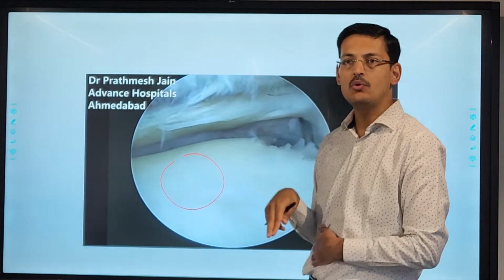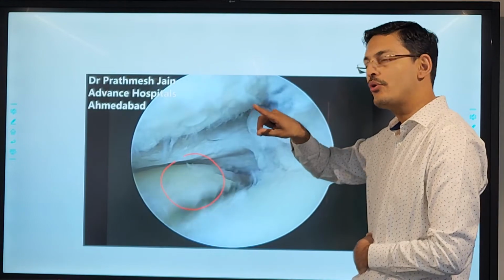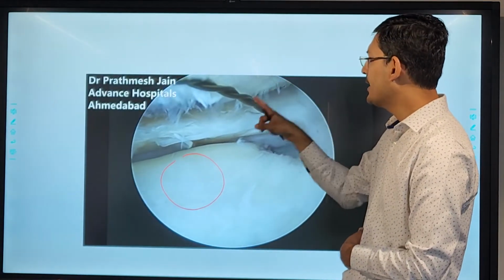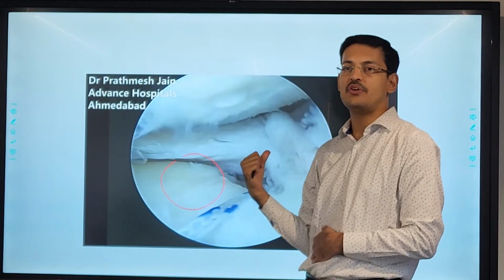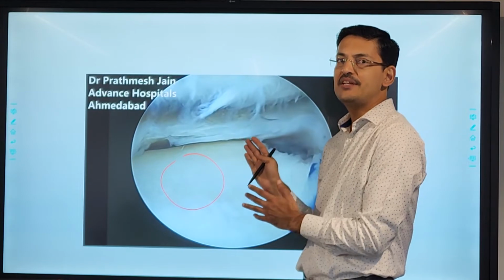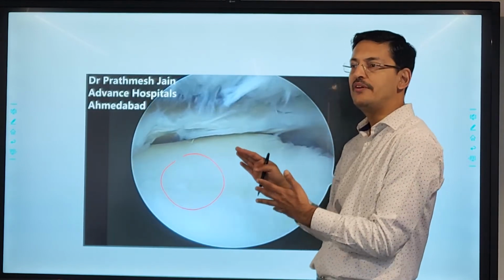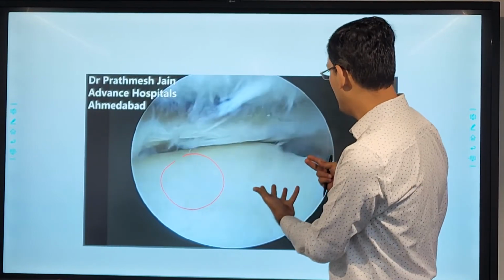And then we'll take out the nitinol wire from there, and we will retrogradely load the anchor from this wire. Now this is easy insertion of the anchor as compared to the posterior medial insertion that I told you before, because this is a very simple technique you can do. You don't need very much extra skill to place this anchor.